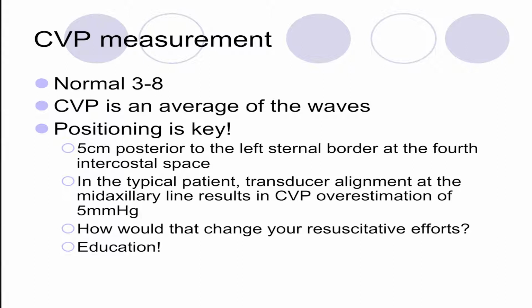Because we ask this question, you hear it all the time, what's their CVP? Oh, I hooked it up and it's 8. It's an idea, but it means nothing to us whatsoever. But if you can tell me, well, yesterday it was trending 3 to 4, now we're 7 to 8, I've got an idea of which way we're headed and what we need.